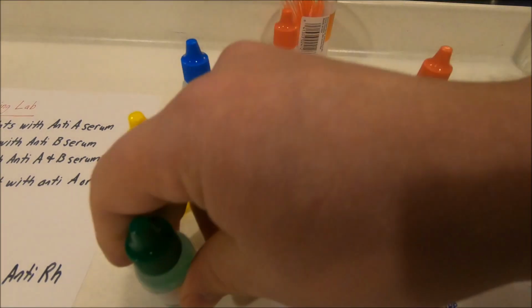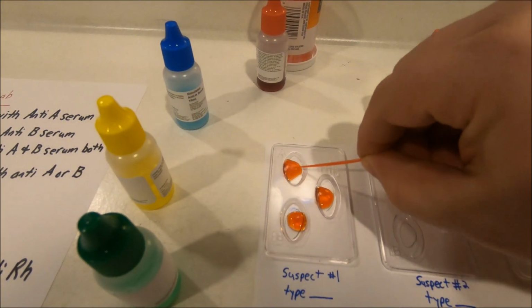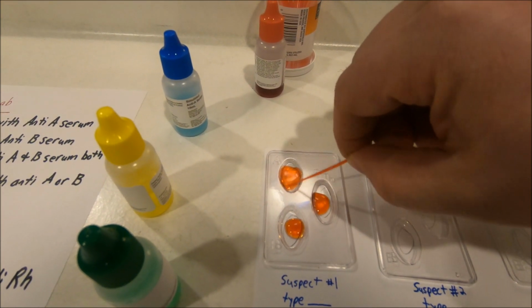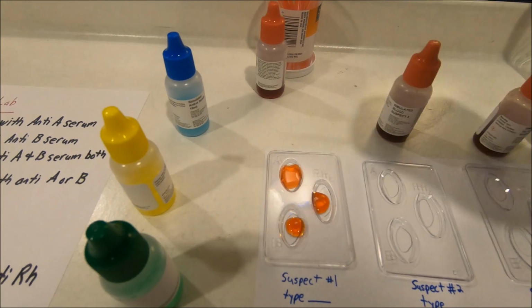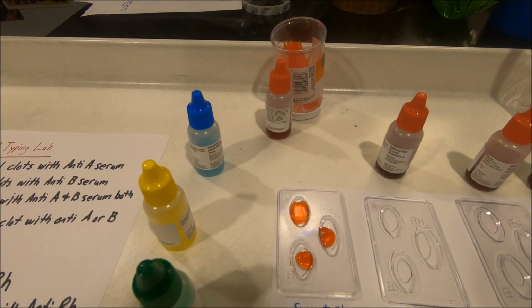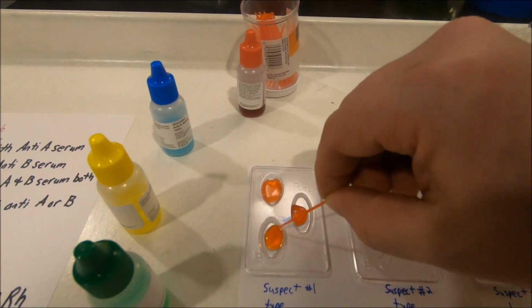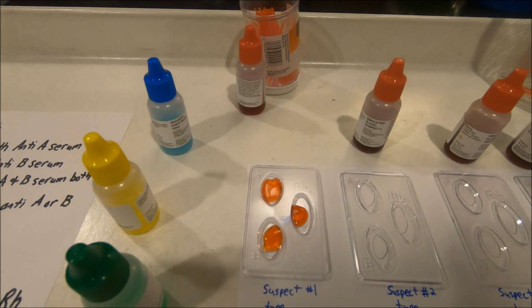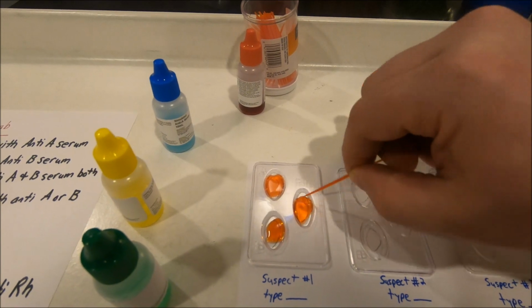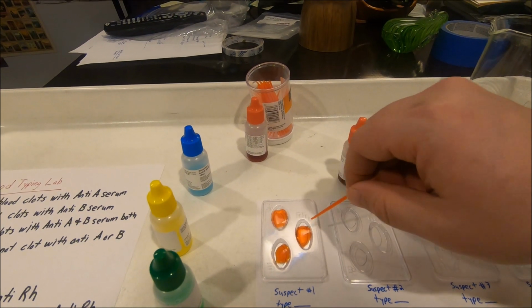Our stirring then is going to take place, and our goal is to see clotting. It tells us that we want to stir for about 30 seconds. After we've stirred, we're going to wait about a minute or two before we check our results. We'll be right back. We're going to fill the other trays and then look at our results.